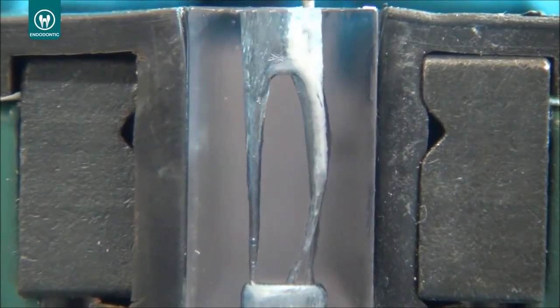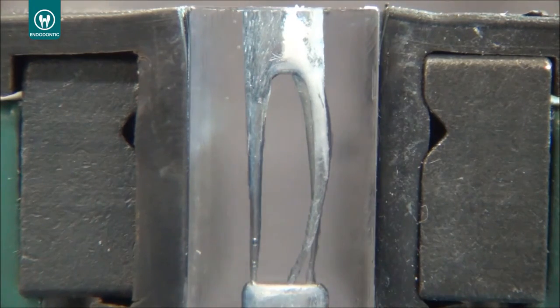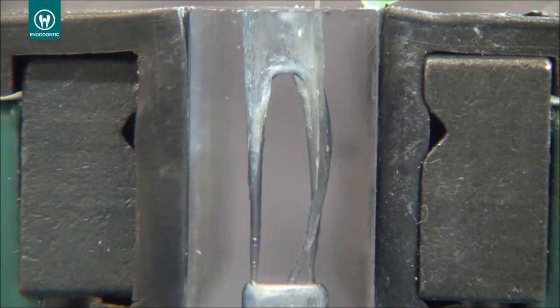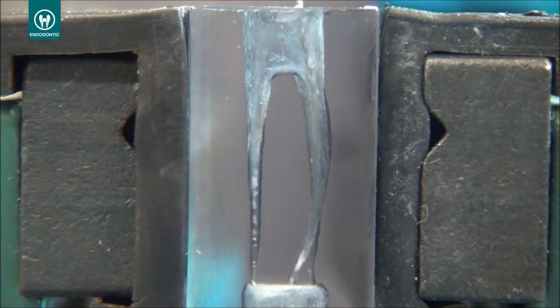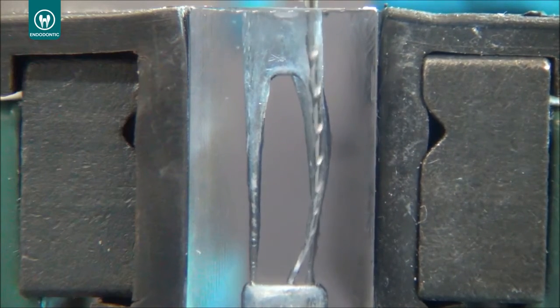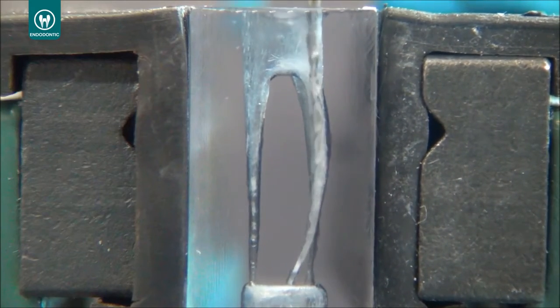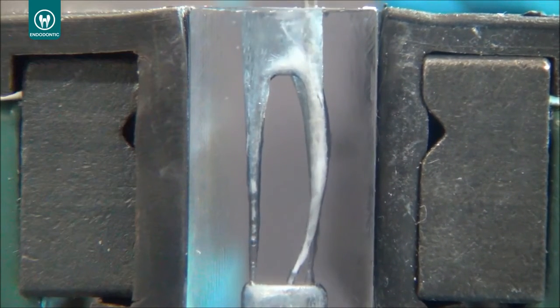So the 35/04 will open space enough and enlarge enough to be able to do all the cleaning with your irrigants. Just remember, it's just 3 strokes in reciprocation, no apical pressure, a lot of irrigation between these strokes. So you can go with your file easily until the working length in reciprocation. What you are seeing in the video is exactly the file going to the working length, opening space properly to be able to remove all this debris with your irrigation.